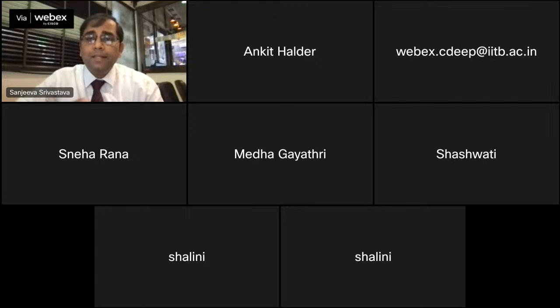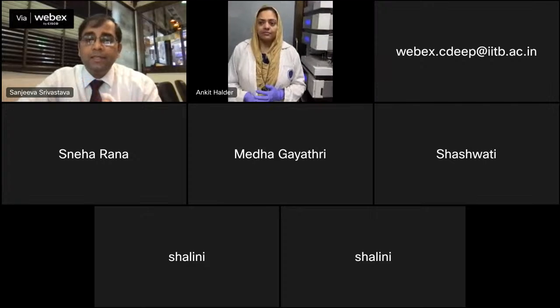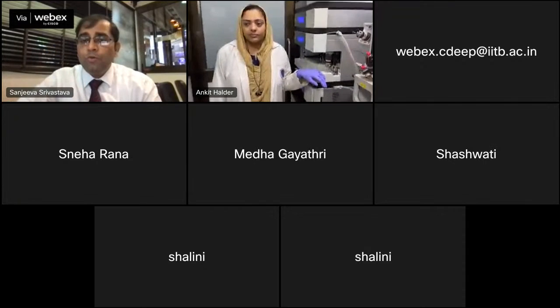The same instruments can be used for both metabolomics or proteomics. But here what you will notice is that we are using HPLC rather than Nano LC, because we want to develop these tests in a very short gradient. So Meher, now over to you.